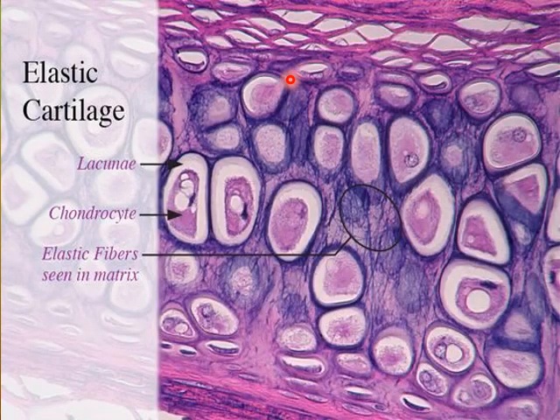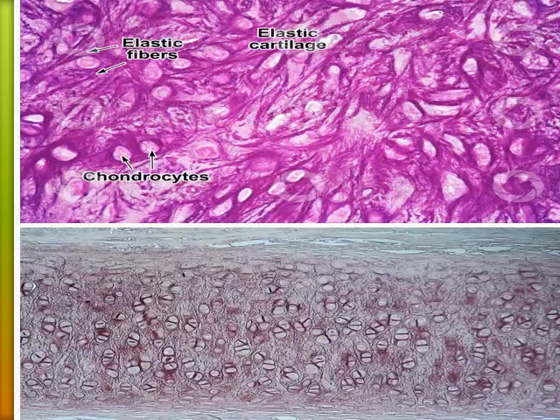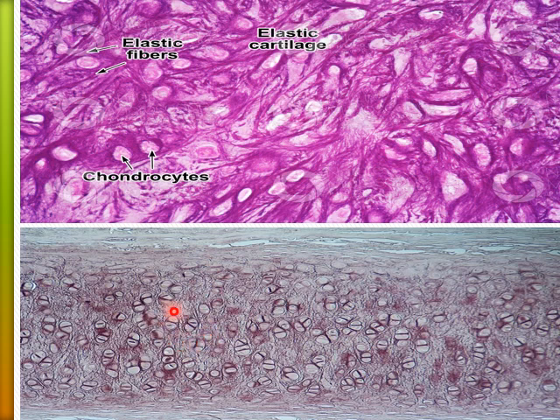This is yellow elastic cartilage. Here is the perichondrium, the chondrocytes, the matrix — which is little compared with hyaline — and these are the elastic fibers. In these pictures, the elastic fibers are visible here and there. The matrix is little and the cell nest has no more than two cells.